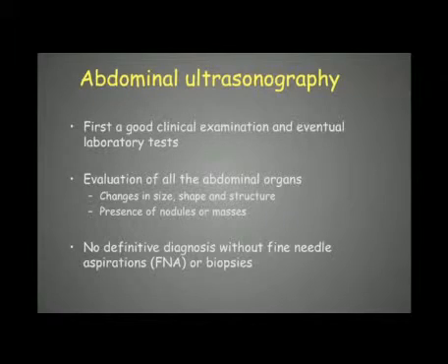And we have to keep in mind that with abdominal ultrasonography, we can't get to a definitive diagnosis most of the time. Just with abdominal ultrasonography, we will always need fine needle aspirations or biopsies of those lesions or those organs to get a definitive diagnosis.